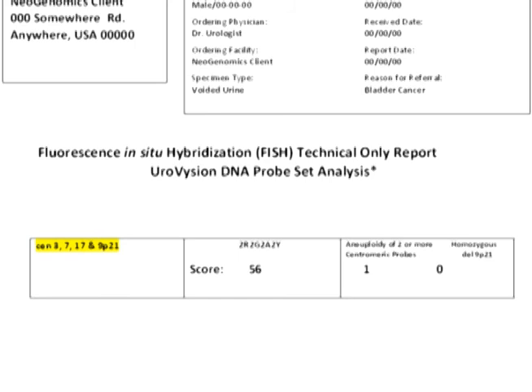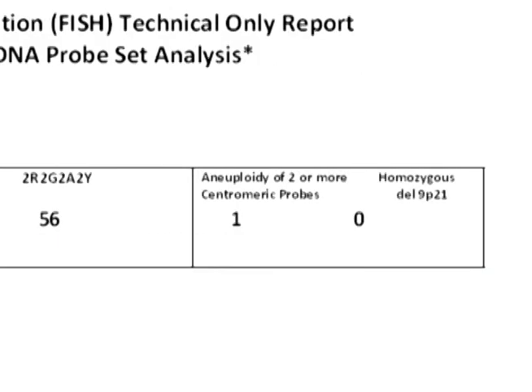We cannot point you in the direction of a diagnosis. We're only doing the technical, but you need to know by virtue of this training, or by virtue of the literature and your understanding as a pathologist of UroVysion, that 2222 is normal. Plus you can look back on page 7 and see what the normal pattern is for UroVysion. And then the right-hand box, with the exception of HER2, which is always the total number of cells counted, the right-hand box is your abnormal cells. In this case, aneuploidy of 2 or more centromeric probes, and/or double deletion of the 9p21 loci.